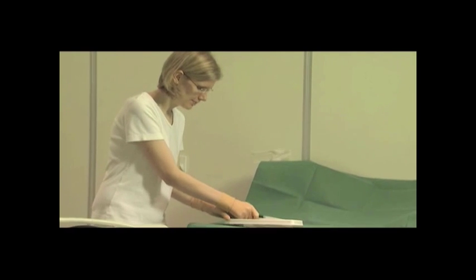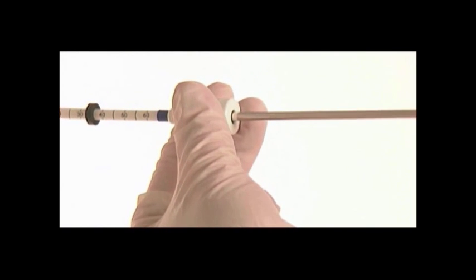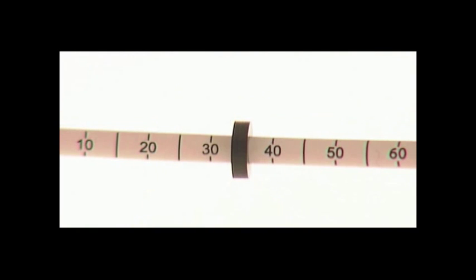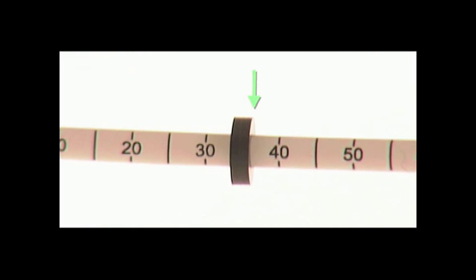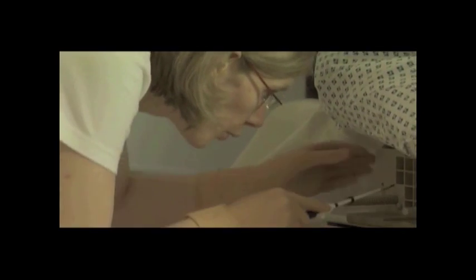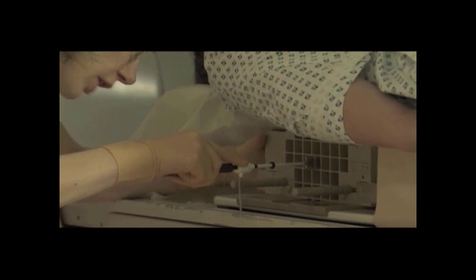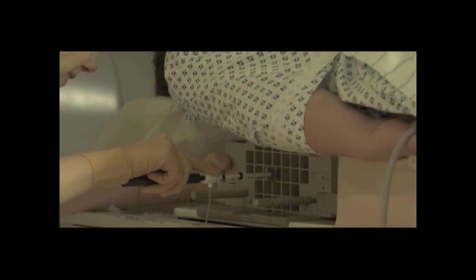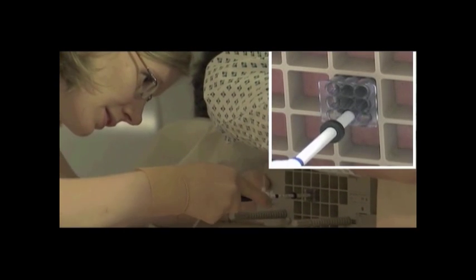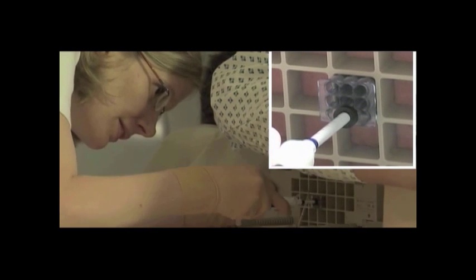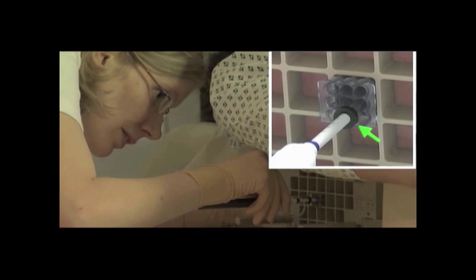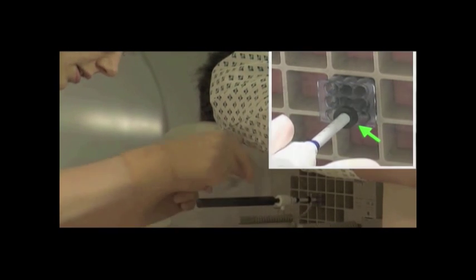Remove the remaining contents of the introducer localization set. Place the introducer stylet into the introducer sheath. Adjust the depth stop on the introducer sheath to the calculated depth of target, reading the depth from the side distal to the patient. Place the introducer sheath and stylet into the selected location of the needle guide. Holding the sheath in place, use a continuous clockwise rotating motion to advance the stylet into the breast. This motion will help minimize tenting of the skin. Continue advancing until the depth stop is flush with the needle guide in the grid.